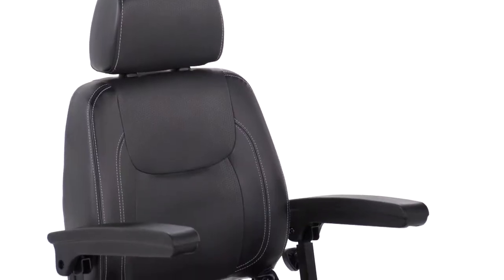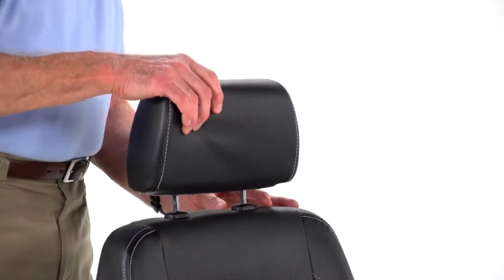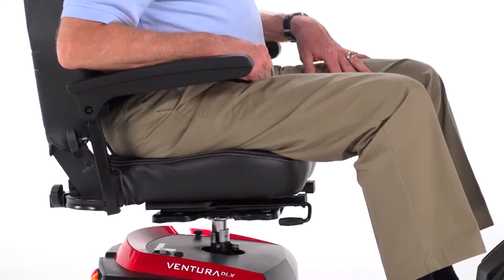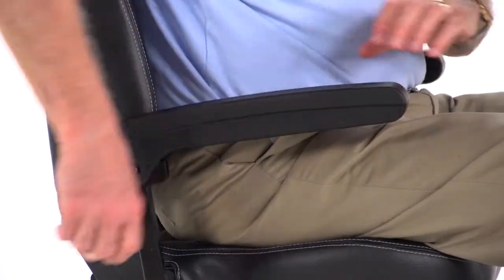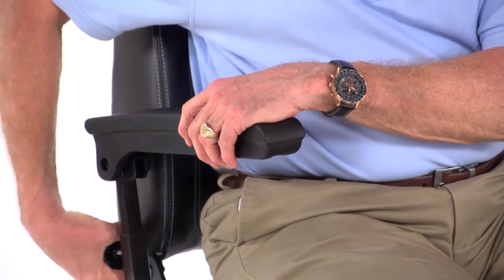It offers your choice of a full-back captain's seat in either 18 or 20-inch widths and an adjustable height headrest. The captain's seat can even be adjusted forward or backward for the ideal driving location. And the Ventura 3-Wheel Deluxe model even offers armrest height adjustment for added comfort.